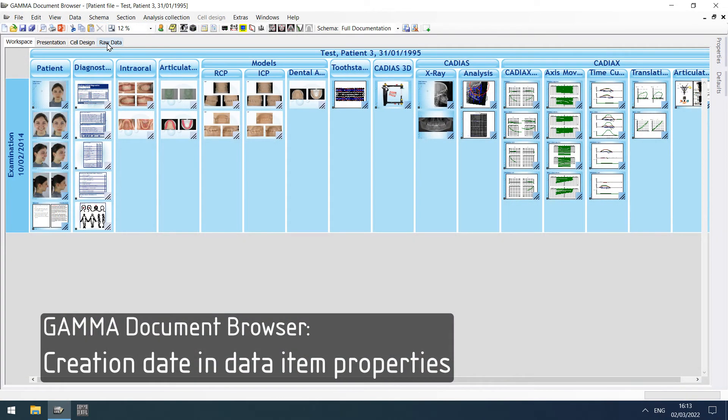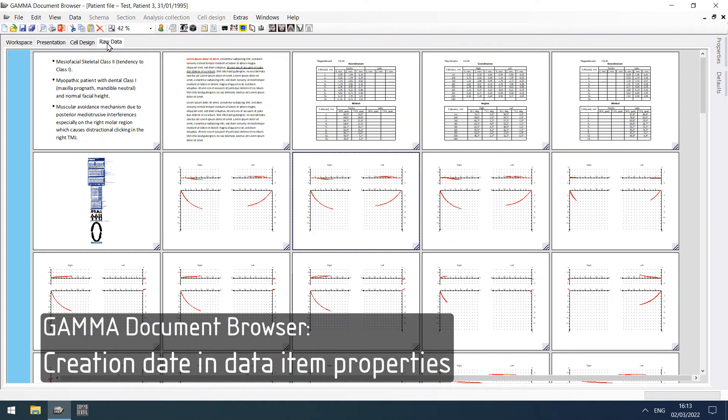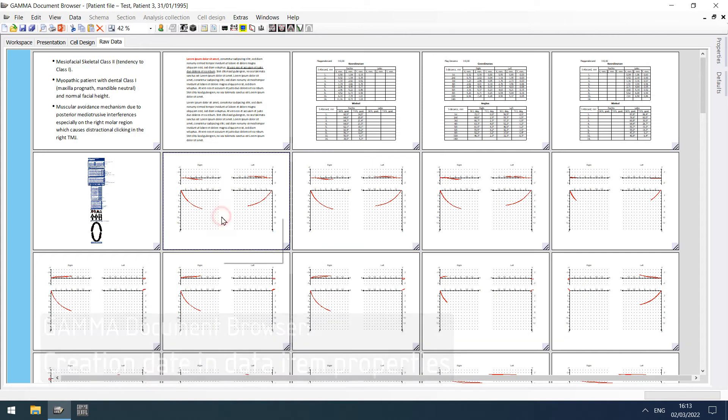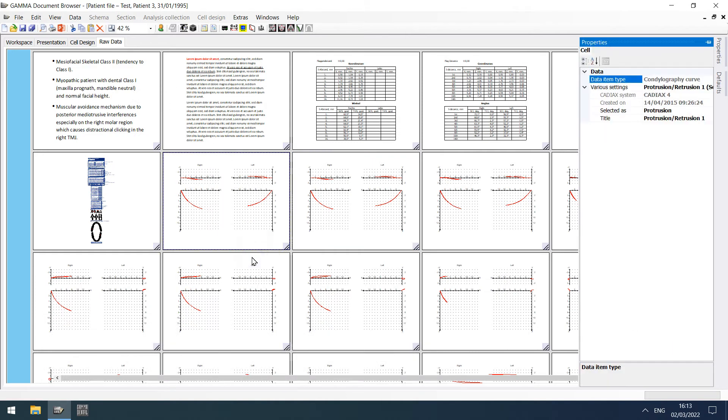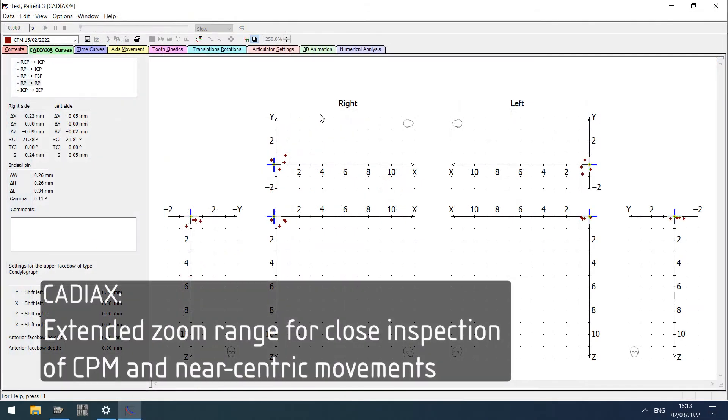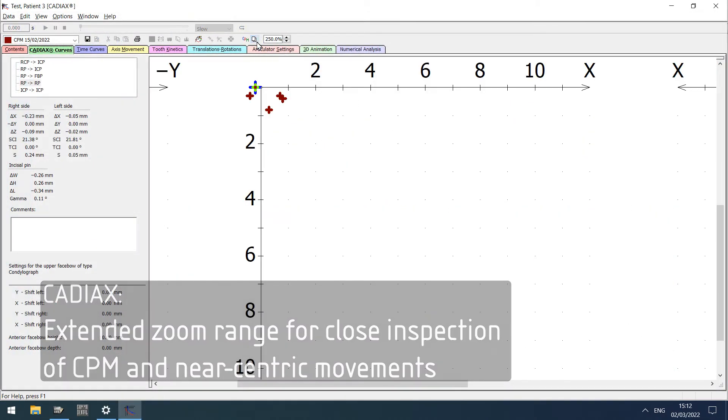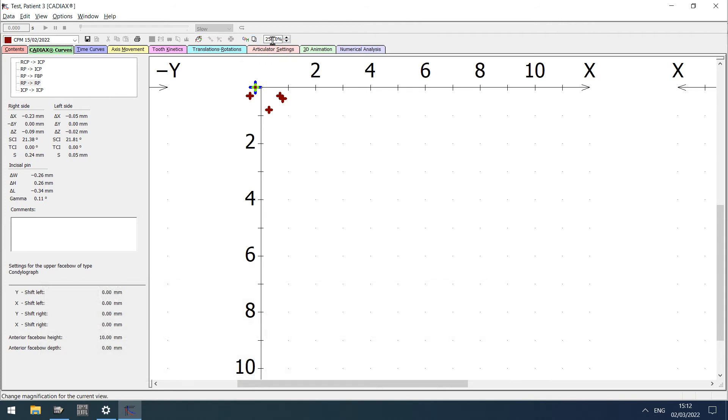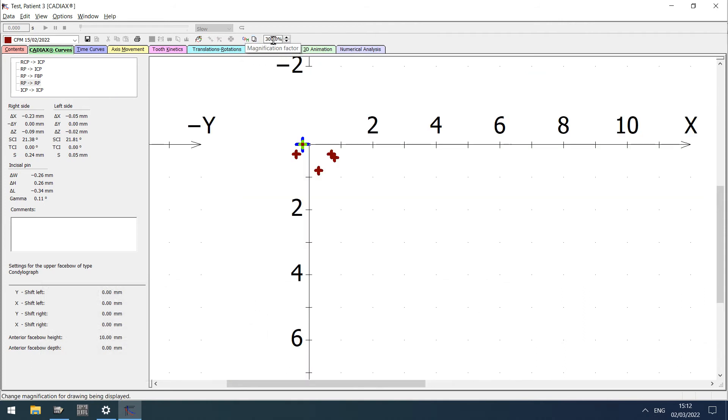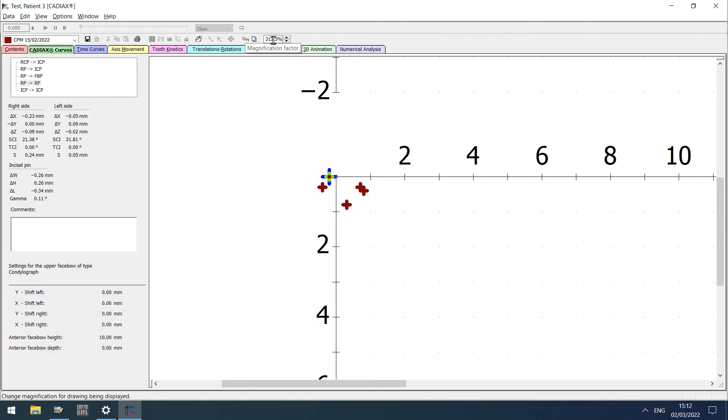In Gamma Document Browser, the data item properties in the raw data view now include the item's creation date, making it easier to tell apart data generated in different examinations. All Cadiax modules now provide an extended zoom range, which allows for closer inspection of CPM and other near-centric movements.